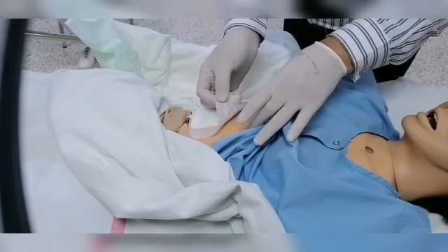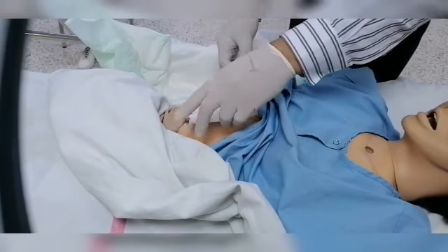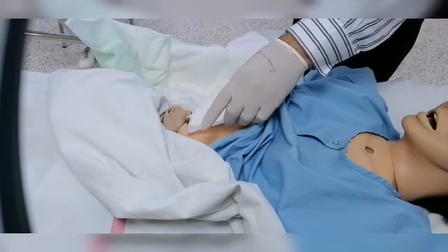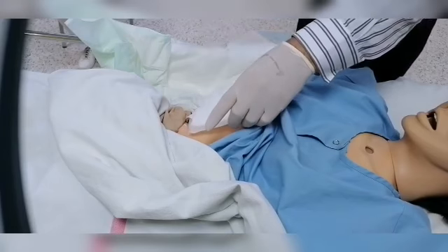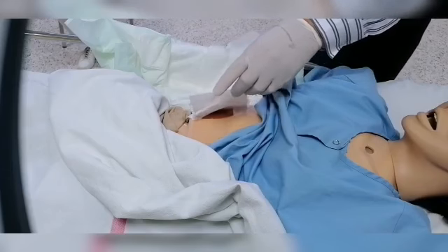I will start with the plaster. If the plaster is stuck there, I can loosen it with normal saline. So I can use normal saline to make it wet. By that, it will come off more easily.